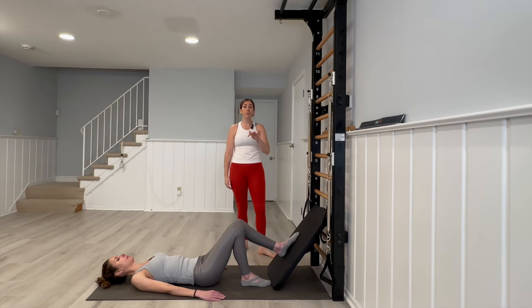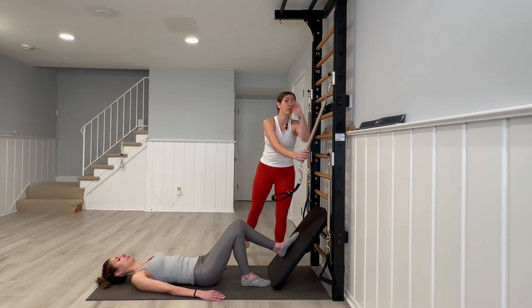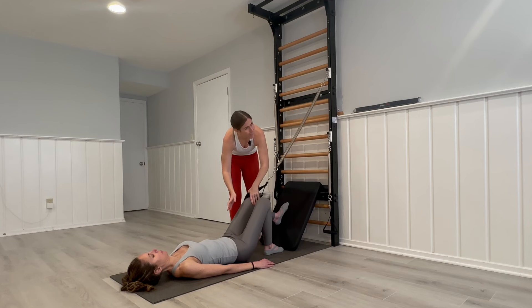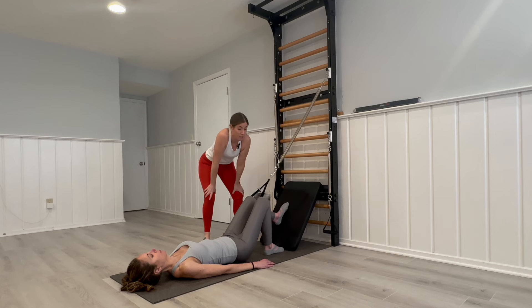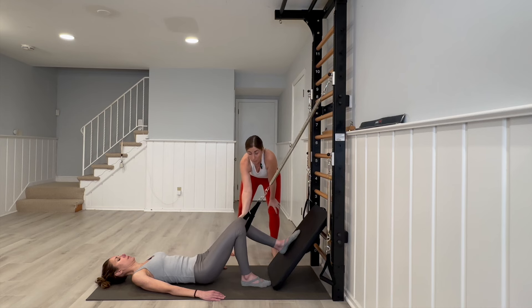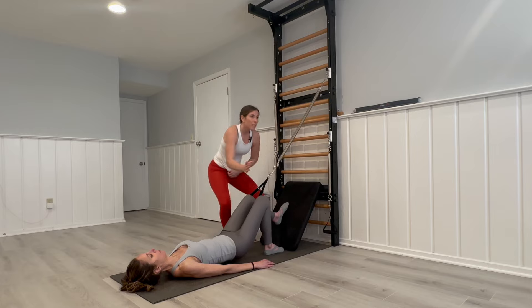Now we're going to look at the bridge, fuse ladder style. What I like to do is take the spring from the right side and cross it over to the left, so then we get a little hip action. From this position I'm just going to ask my client to go up into a bridge and back down, asking them to keep pressing into that side of the strap as they go.